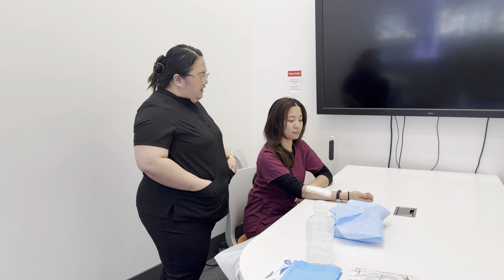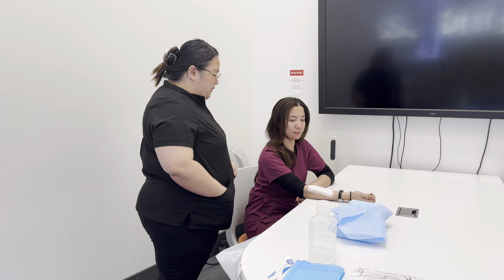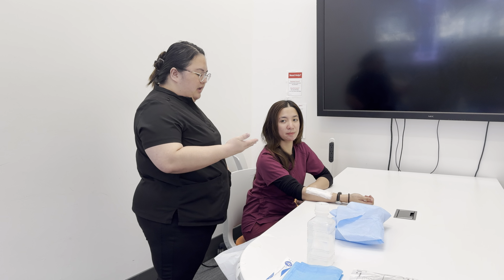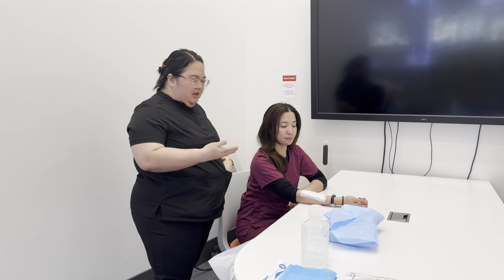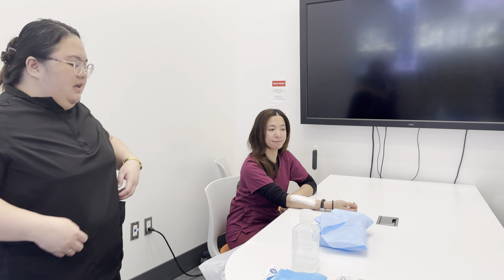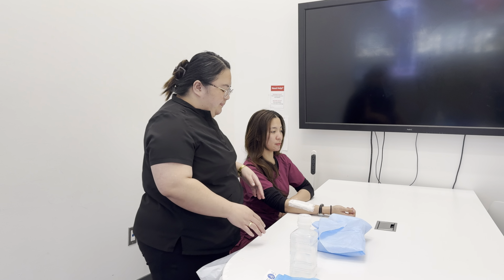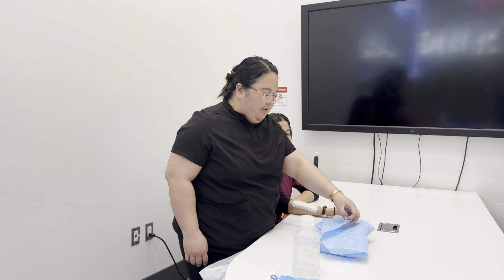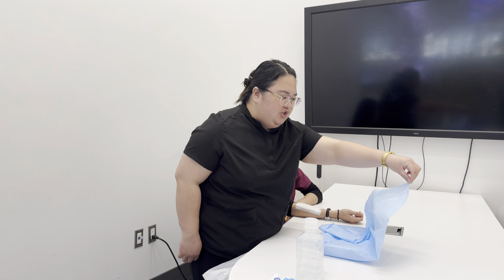Please tell me your complete name and your date of birth. Charmaine Santos, January 31, 1993. Okay, it's the same record as mine. I will now perform hand hygiene and provide you privacy. Now I'll prepare my wound care kit by opening it. Make sure that the flap is away from you, maintaining the 1-inch border.